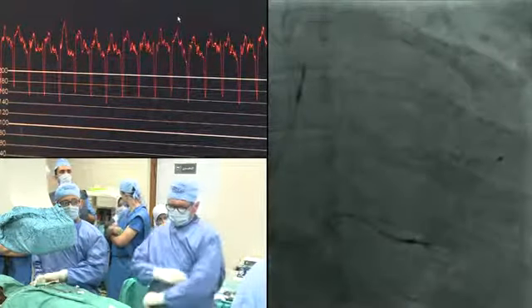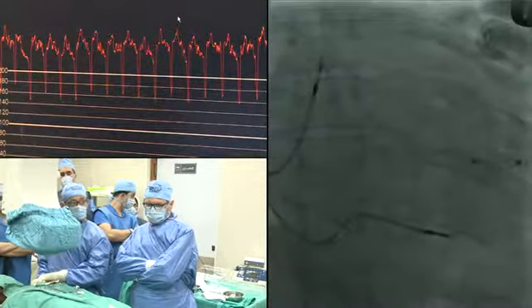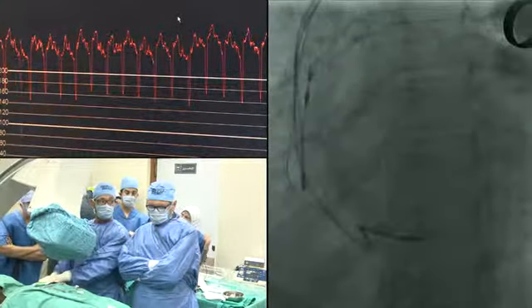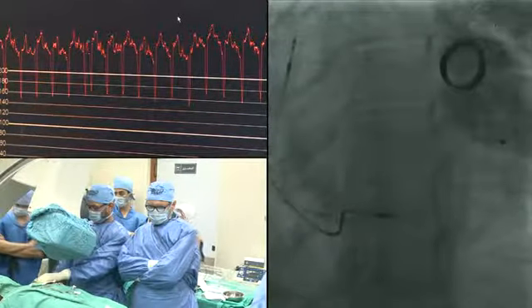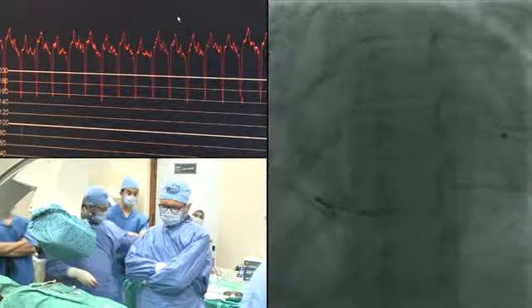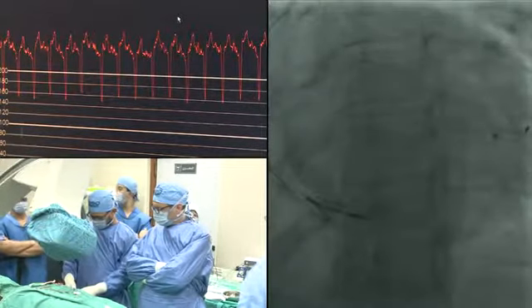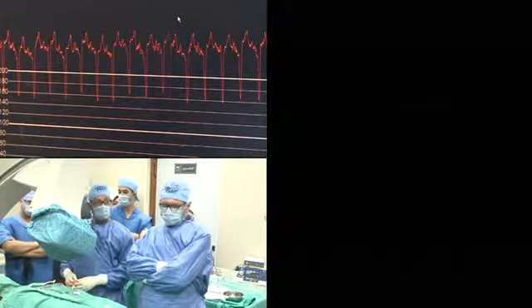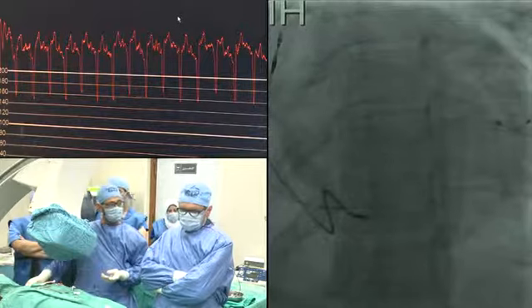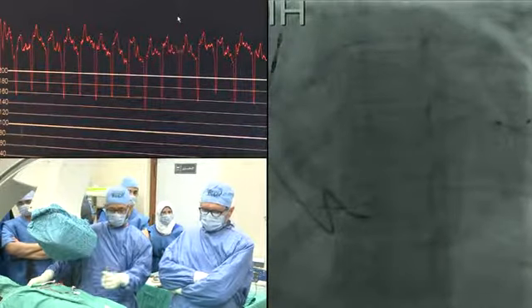I typically use the AB view, but we can check the LAO view. I would say I don't typically look while I'm slitting anyway. The most important thing is to see the lead fixed in place while slitting, irrespective of the view.